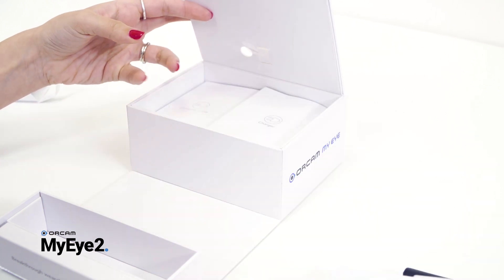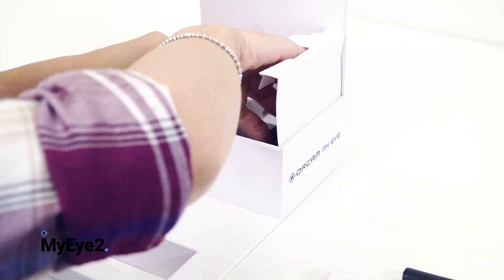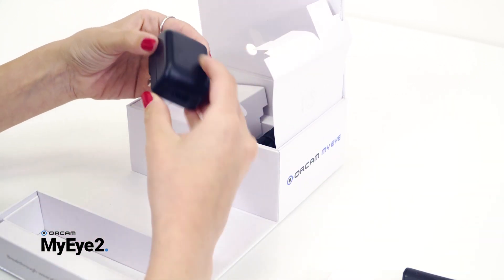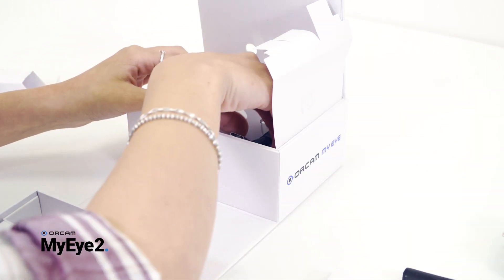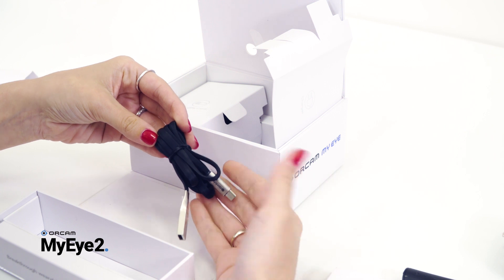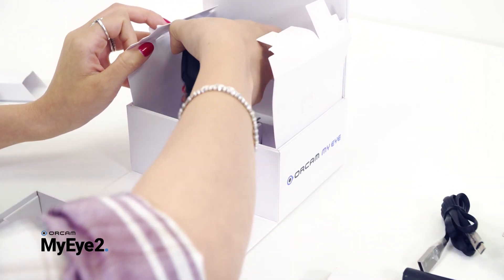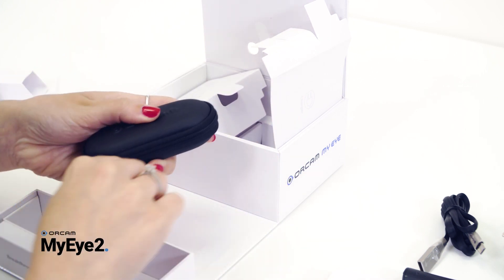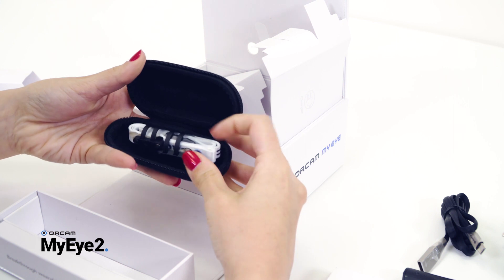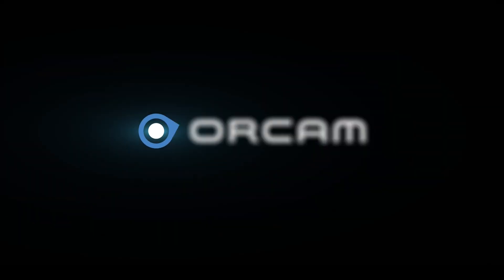Under these items you will find two compartment lids. When you open them you will find the OrCam charger and cable, a pouch with additional plastic mounts, and a lanyard.